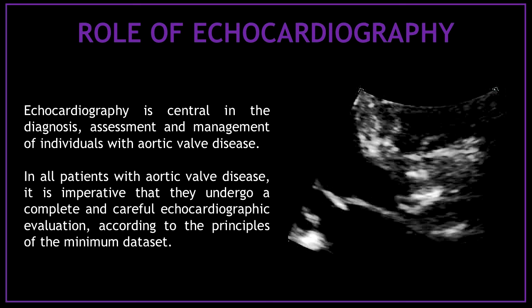And what is the role of echocardiography in aortic stenosis? Echocardiography is central in the diagnosis, assessment, and management of individuals with aortic valve disease. In all patients with aortic valve disease, it is imperative that they undergo a complete and careful echocardiographic evaluation according to the principles of the minimum dataset.